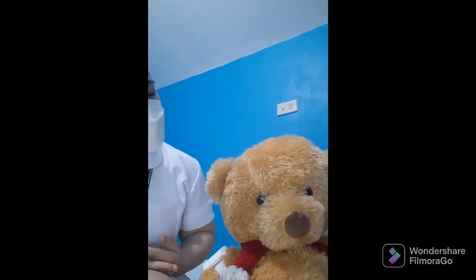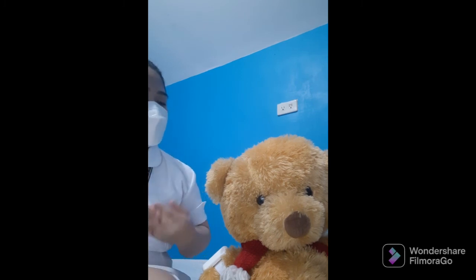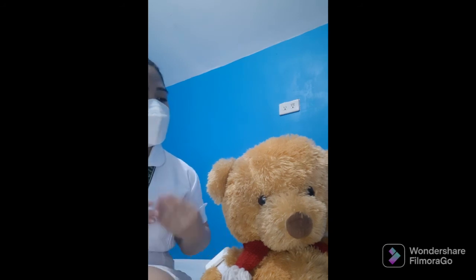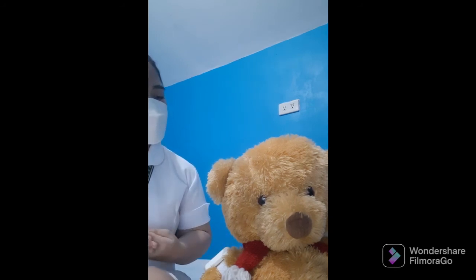My name is Charlotte Benabi Bustamante, your student nurse for today. So, sir, ano pong pangalan nila? Okay, Sir Brown. Sir Brown, ang gagawin po natin sa inyo is mag-administer po tayo ng medication through subcutaneous injection. So, we're going to use yung arm nyo po, sa likod po ng arm, since marami pong fat doon. And we administer it by 45 to 90 degree angle. So, okay lang po ba yun sa inyo?